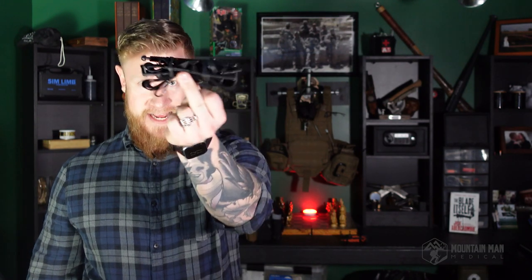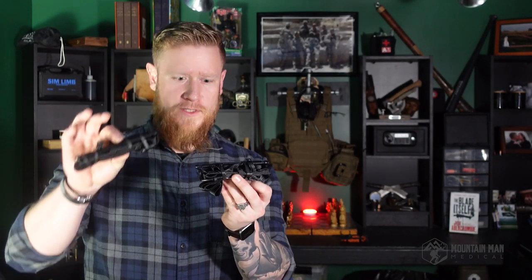Something I'm really kind of cranky about when it comes to the Soft T Wide is that you get it in the package looking like this. It's not flat folded. It's not ready to go. So if you're going to purchase one of these, I really recommend that you do this flat fold method. It helps to keep everything nice and neat and organized in your pocket or in your trauma kit, because when you want to get this out, you want to make sure it's not getting all hung up on everything.